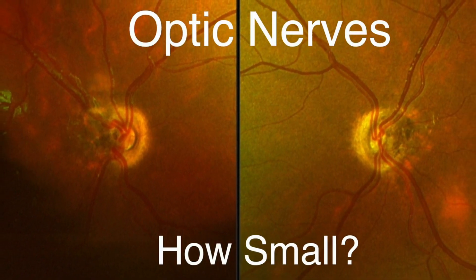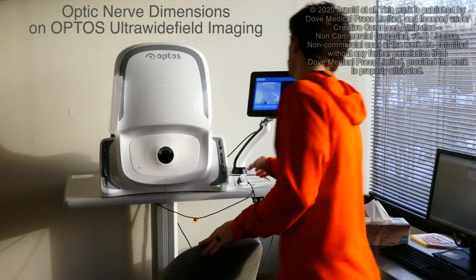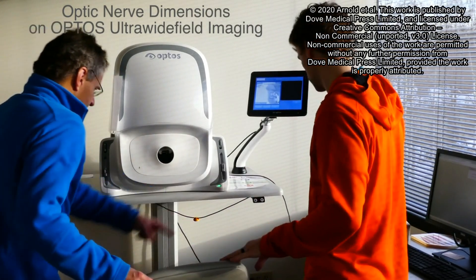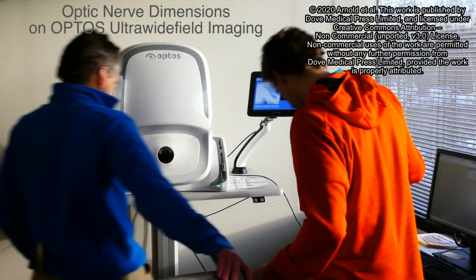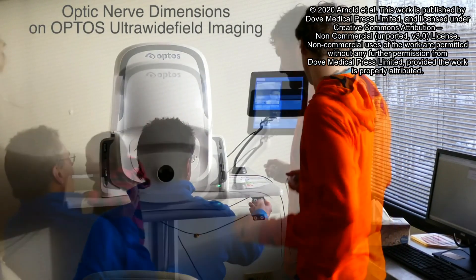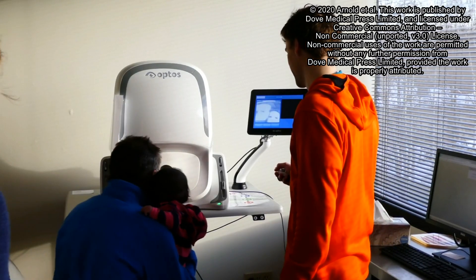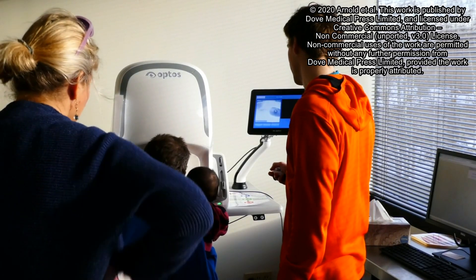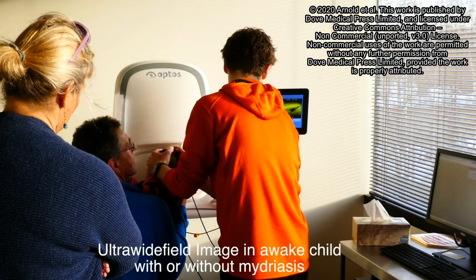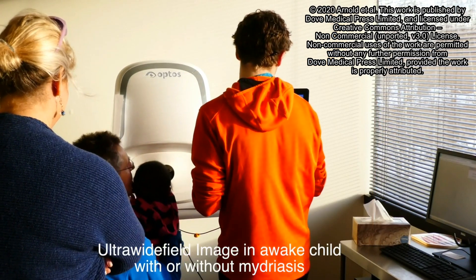How small are these optic nerves? With Optos Ultra Wide Field Imaging, it is possible to get high-resolution images from children's retinas, even while they're awake, with or without mydriasis.